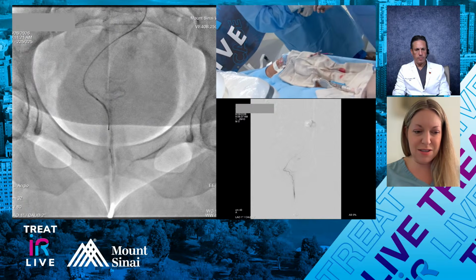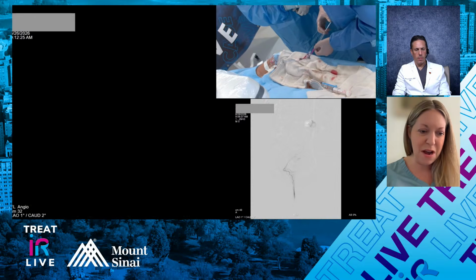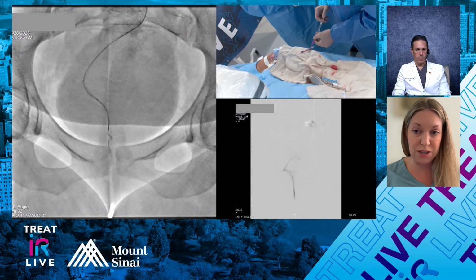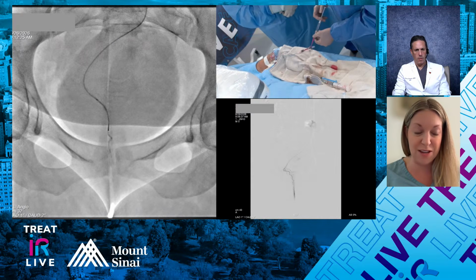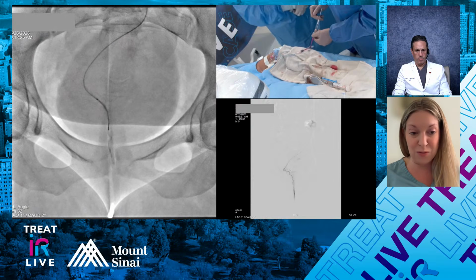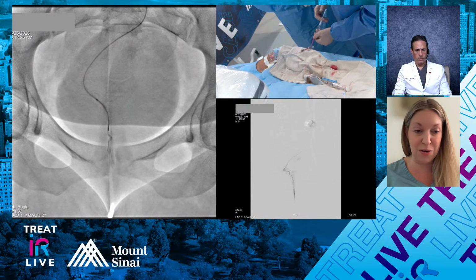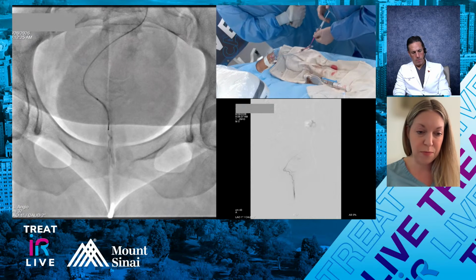I'm just going to give 1 cc. Yeah, I think this is a great question because these things can open up and reperfuse from other areas. Personally, I want to get as selective as I can because I want to spare normal rectal perfusion as much as we can. But other arteries can open up and reperfuse that area, which we've seen happen. They've started contributing to that CCR. In general, most of us are getting as selective as we can, but a lot of people go more proximal, of course. I don't think we've really teased out in the literature which one's going to be better as far as recurrence or length of procedure. But yeah, these 7 to 9s are always a little chunky.